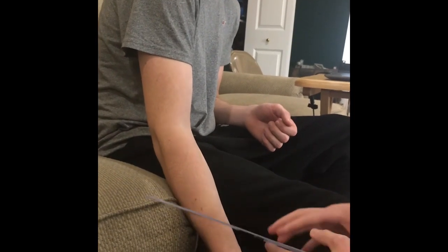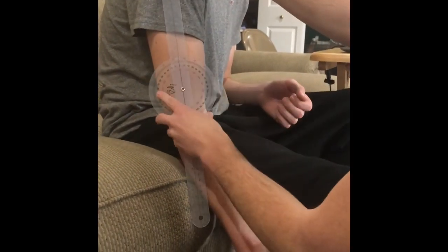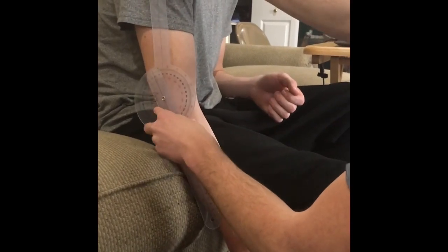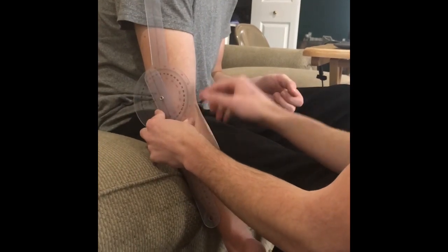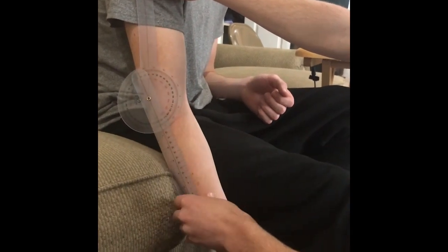So now we're going to be measuring elbow flexion of the arm. In order to do this, you would position your stationary arm, make sure it's lined up evenly with the head of the humerus or your deltoid or your acromion process up here, and make sure that the axis of movement is even with the elbow joint. And then you're going to be lining up your movement arm with the radius down in your forearm.